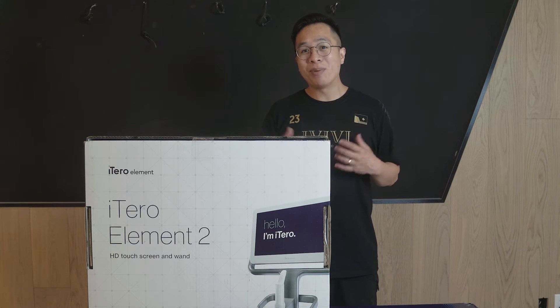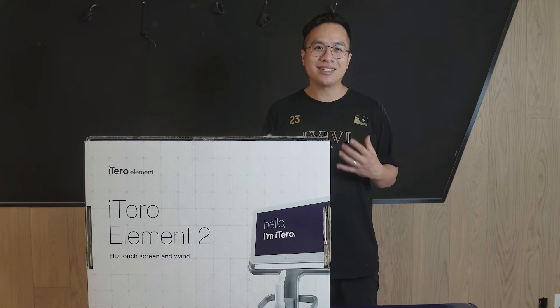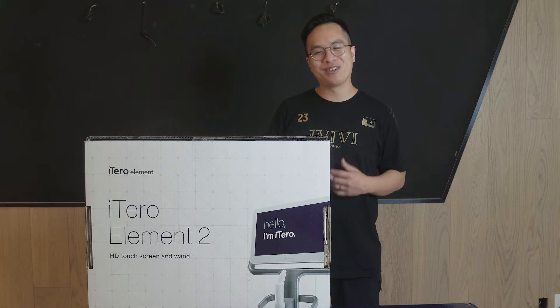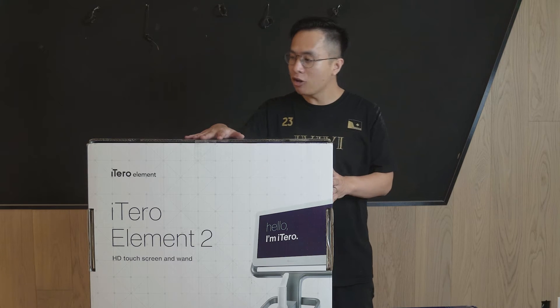In a future video the 416 Dentistry team will be sharing more information about IOS technology, but today let's get right into it. Since it may take a while to assemble the iTero Element 2, we're going to speed up parts of the video. The iTero Element 2 comes in two boxes — one smaller box and then another bigger box.